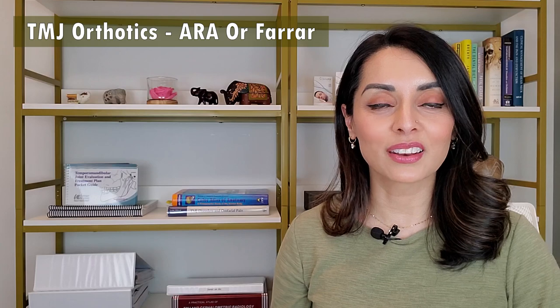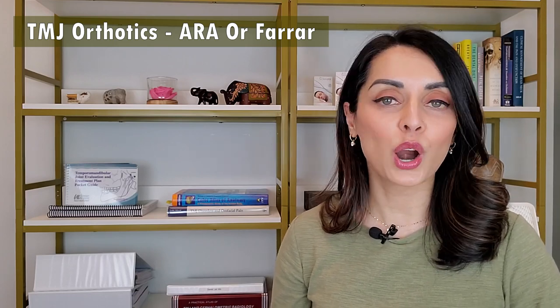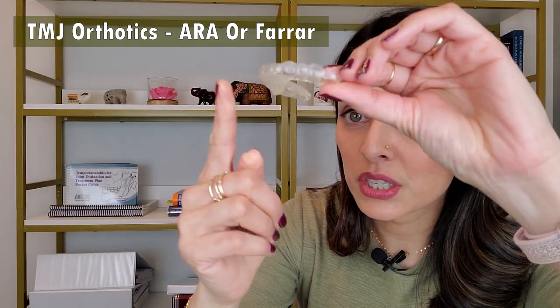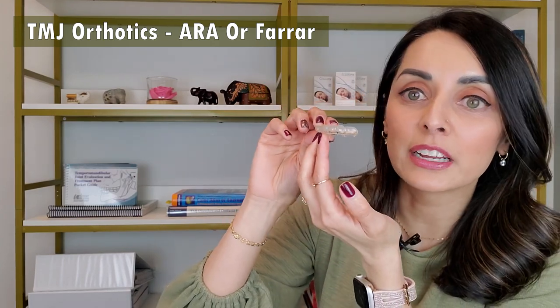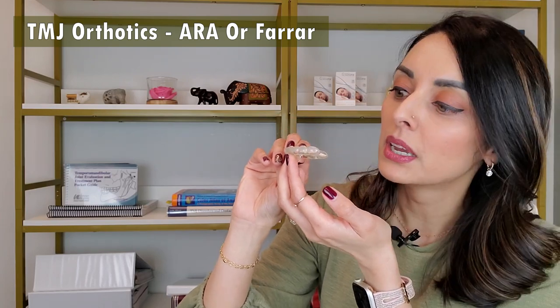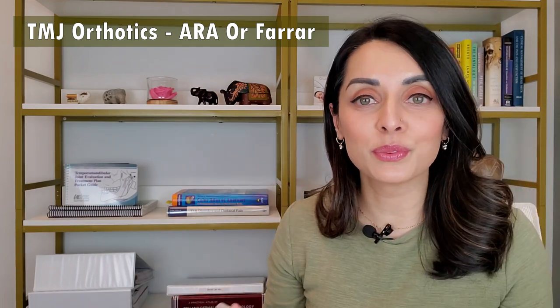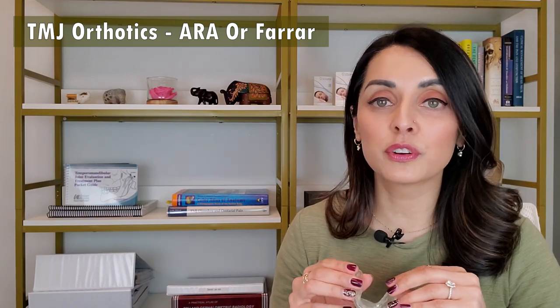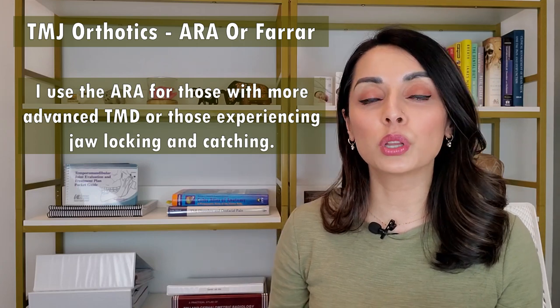Now let's take a look at the other type of appliance I use a lot. This is called the ARA — Anterior Repositioning Appliance, also called the Farrar Appliance after Dr. Farrar who came up with this. This one is different because it fits on the upper teeth and it has a flange that comes down. When worn, the bottom teeth fit in front of that flange, thereby holding or guiding the jaw forward. So even if the jaw tries to drift backwards during sleep, the flange prevents it from doing so. This ARA also has indentations all the way around with the specific prescription built into it — those indentations guide the lower teeth where to rest, putting the jaw in a very specific three-dimensional position that's good for the muscles and the joints. I often use this ARA appliance for patients experiencing more advanced TMJ conditions or locking or catching of the jaw joints.